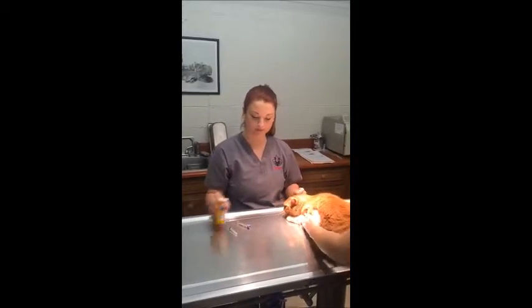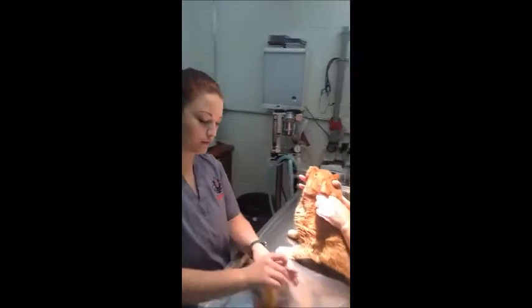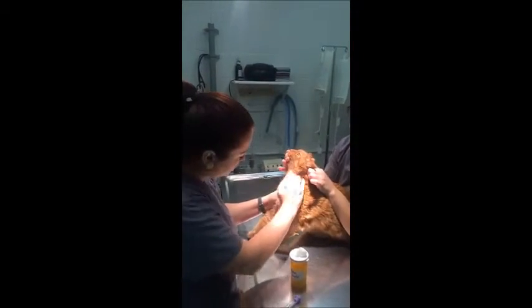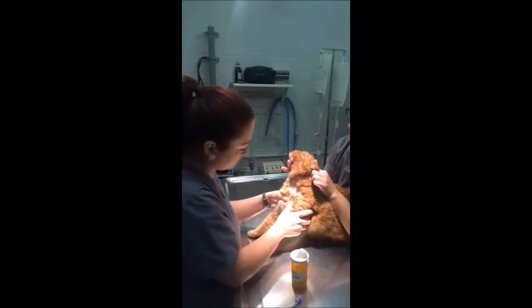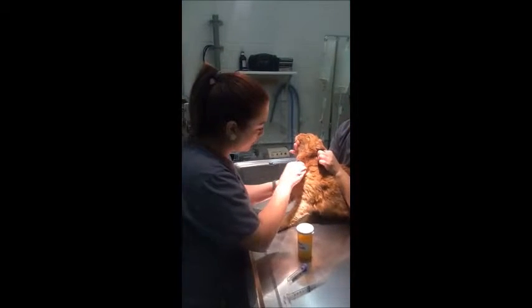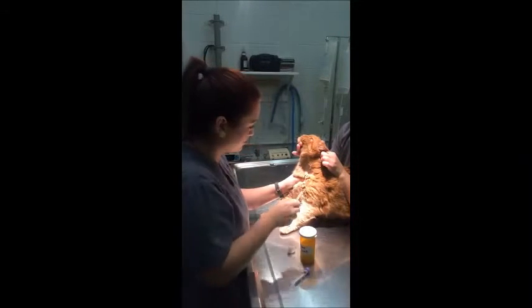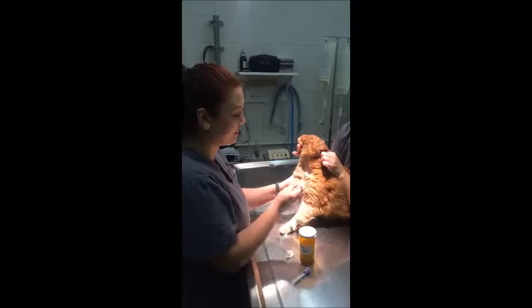I'm going to have my restrainer hold off for me. I'm going to apply pressure and locate the vein. Then I'm going to sterilize the area. I've got my index finger located at the bottom and my bevel side up.